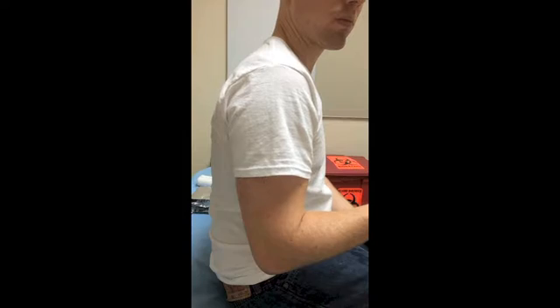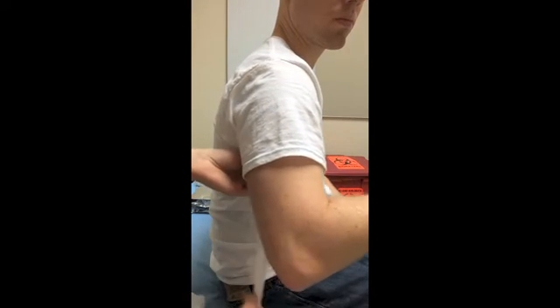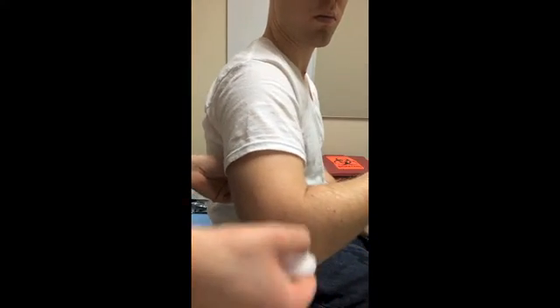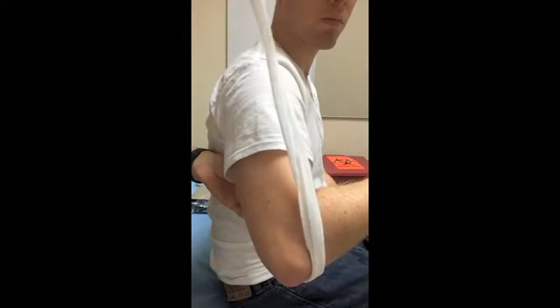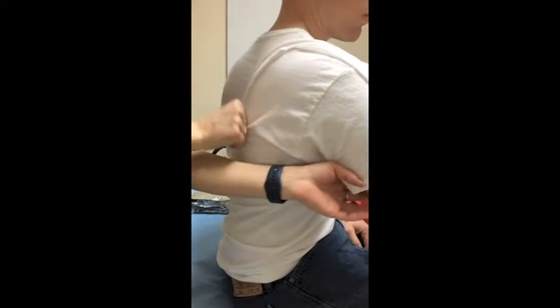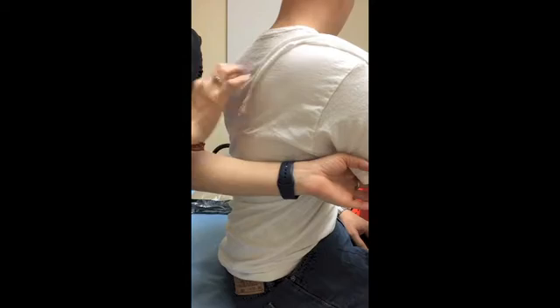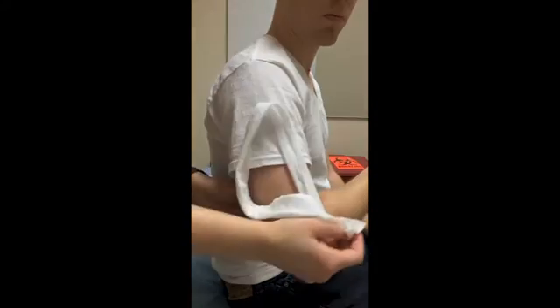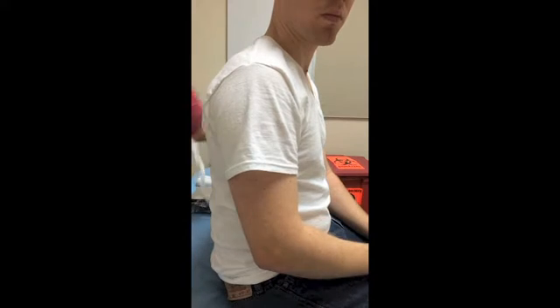So when we go ahead and measure, we'll start underneath the arm, just where we talked about, up high, nice, close and tucked into the armpit. And then we're going to bring this measuring material down, around, and to the mid-scapular area. So once we've got this measured, we can go ahead and cut our splinting material, and then we're going to work on padding.